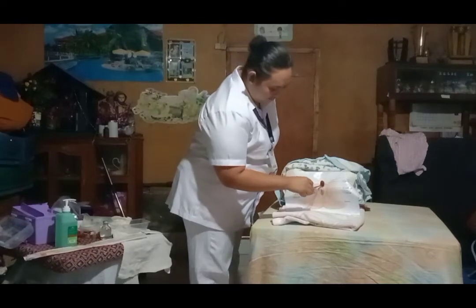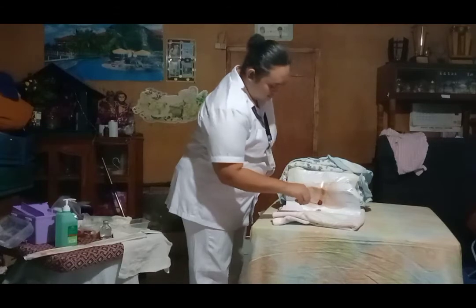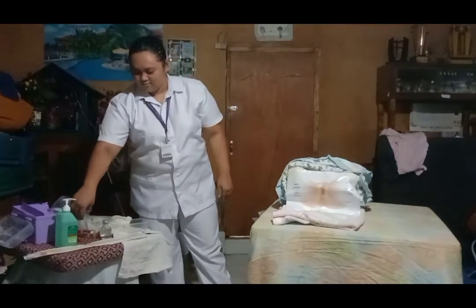First, in the line down, I will do it in the line, then down, and then I'm going to discard it. So next is the labia majora.